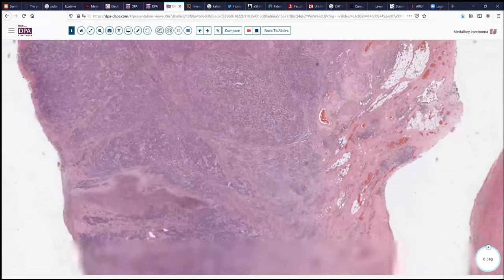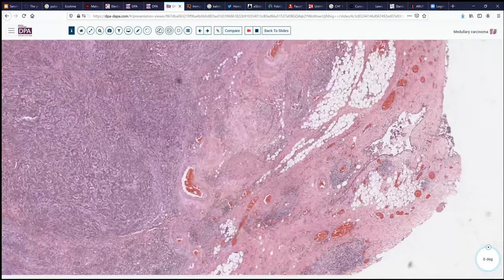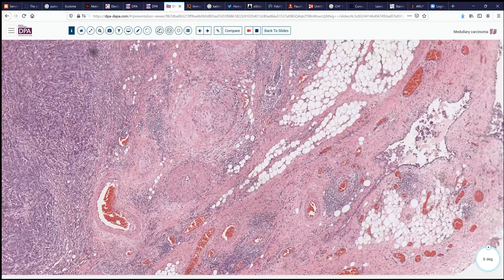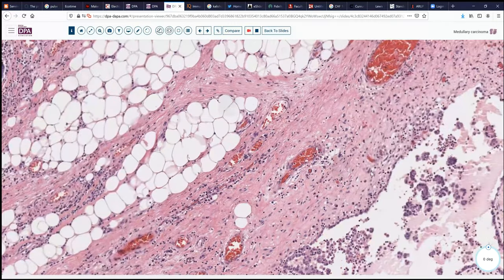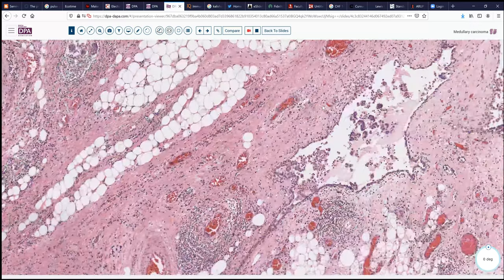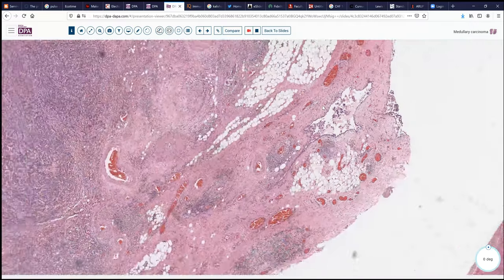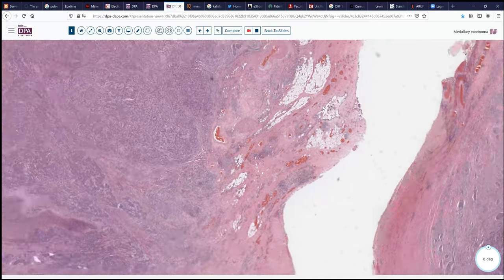We'll look at the other fragment here. Let's see, we can see here the mesothelial surface shows pronounced proliferation of mesothelial type cells, although it's possible these could be tumor cells that have reached the surface. And that obviously would change the staging. They look a little bit concerning, so we might want to stain those and evaluate for the potential involvement of the surface by this tumor.